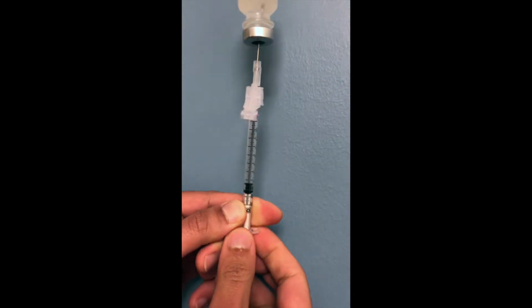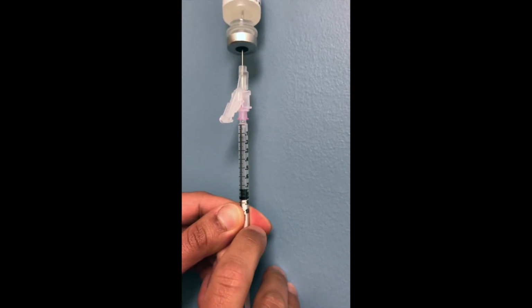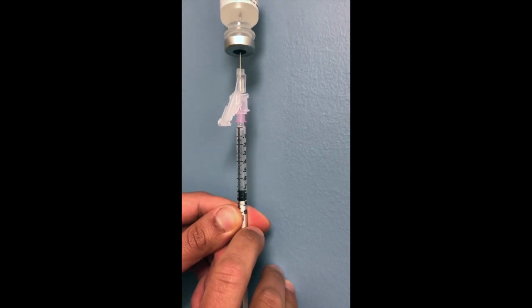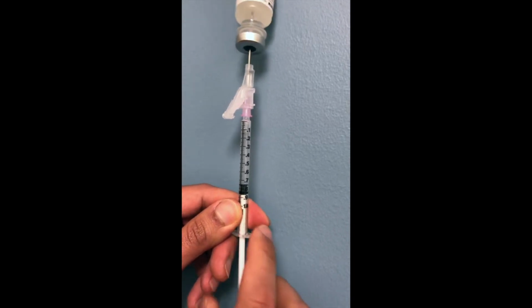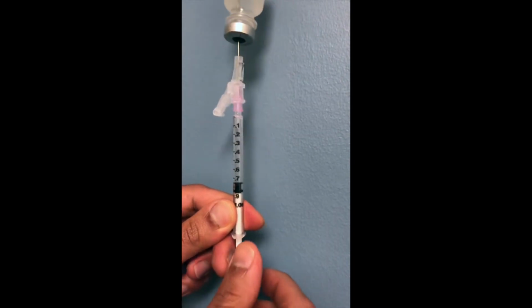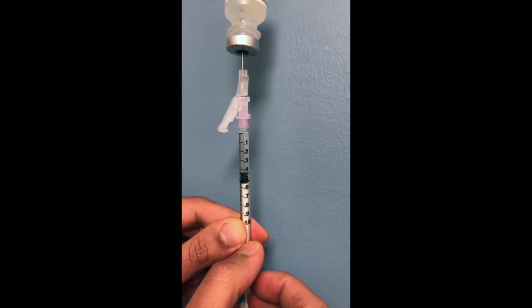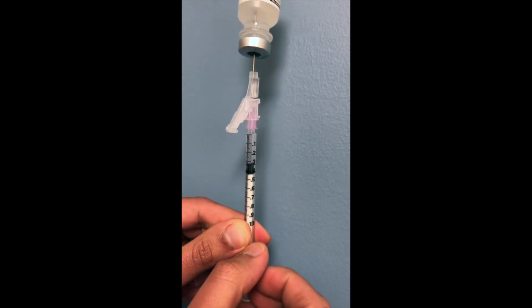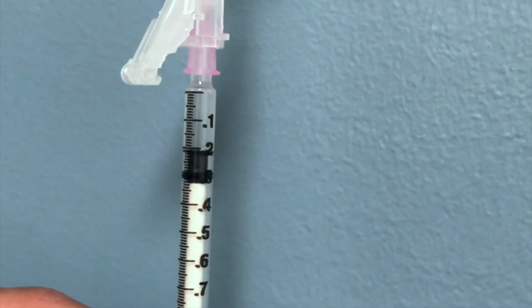So now I can adjust my dose to what I need. In this example, we're pulling up about 50 milligrams of testosterone, which translates to about 0.25 ml of testosterone. So now we can adjust our dose to 0.25 ml. I can push that back in along with the air, and let me show you where 0.25 is. This is right here, the big hash mark, that's 0.2.